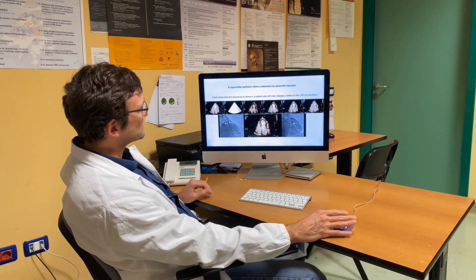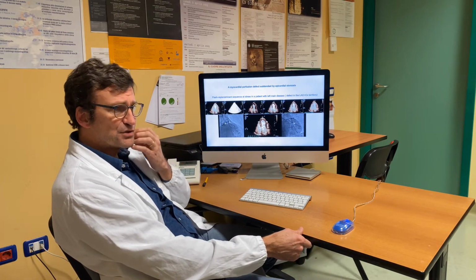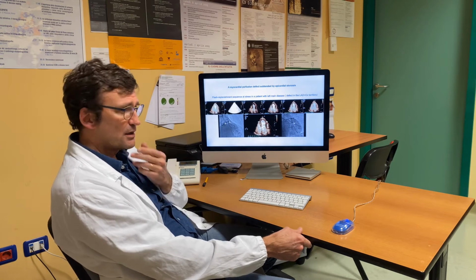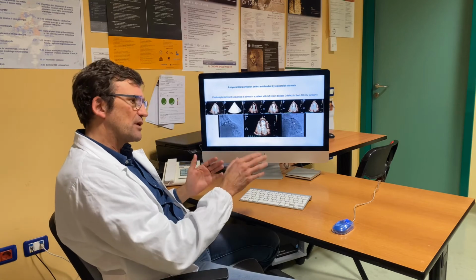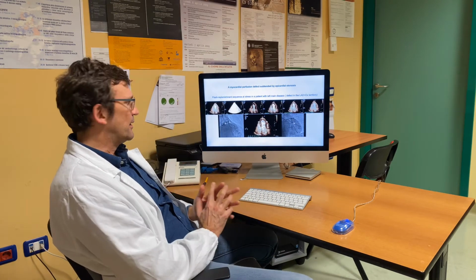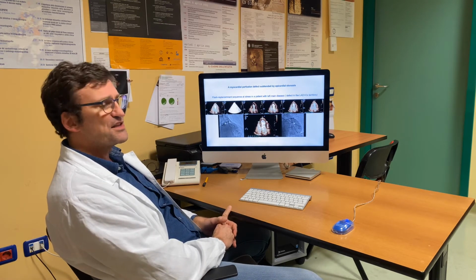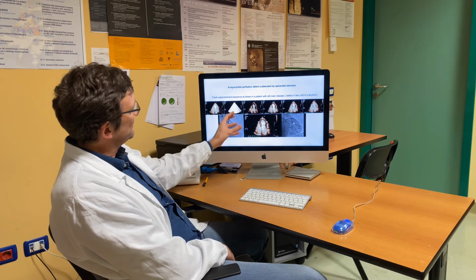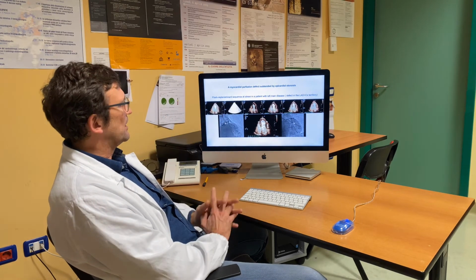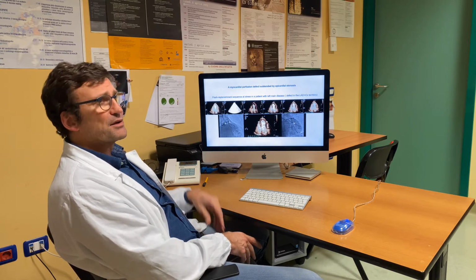And so it's a brilliant method to assess perfusion. It's not that different from cardiac magnetic resonance, for example. In magnetic resonance, you use the phase when the contrast is injected, and here you deliver the impulse and you see how it works after that. But it requires good images.